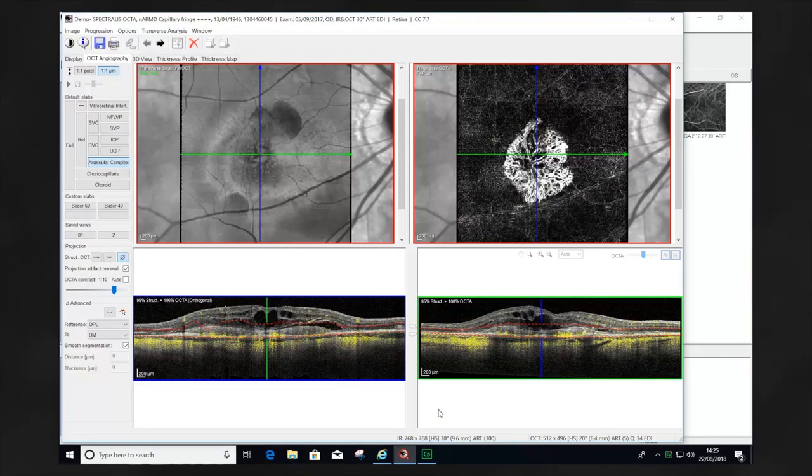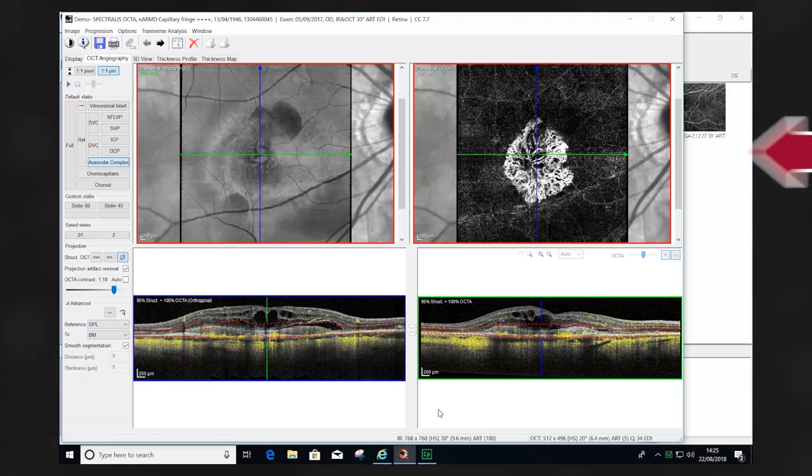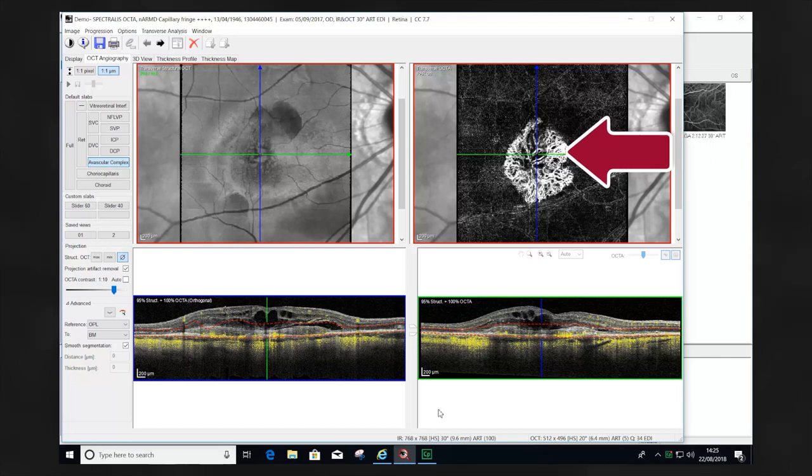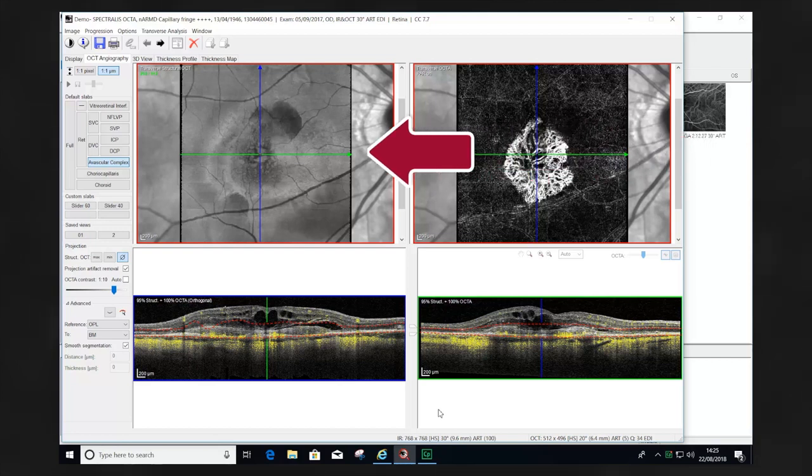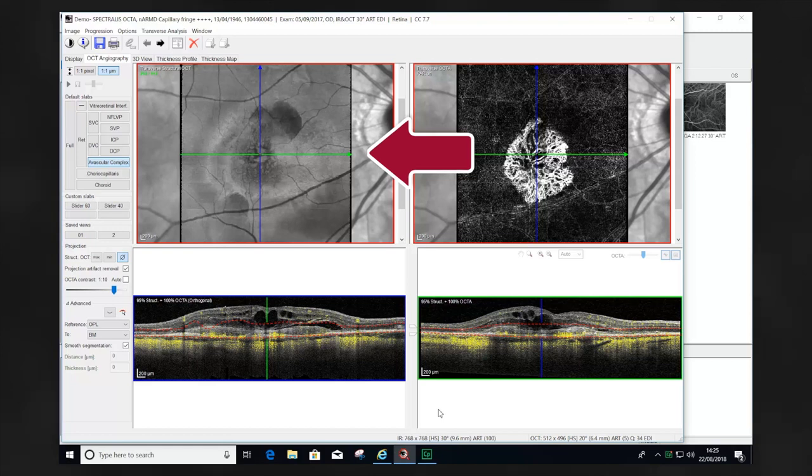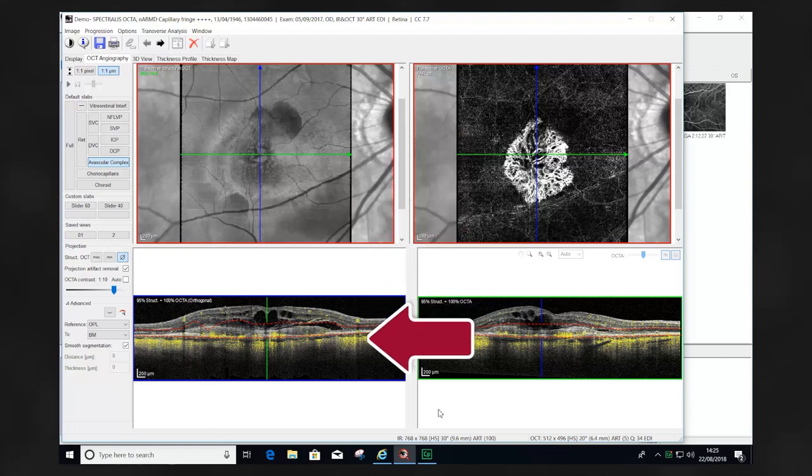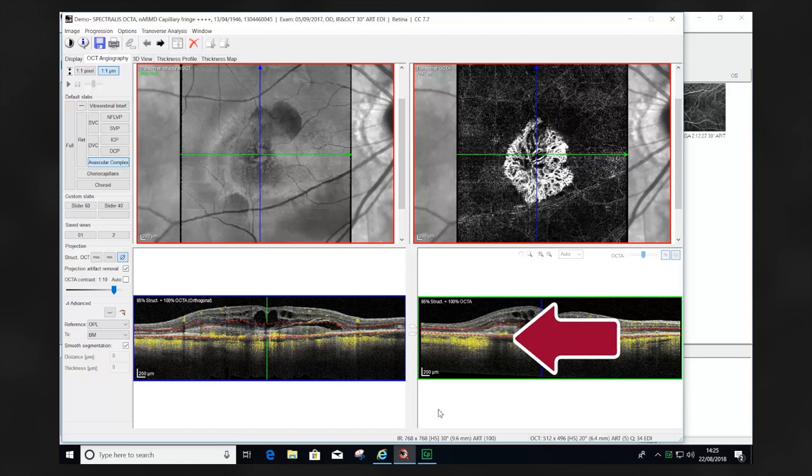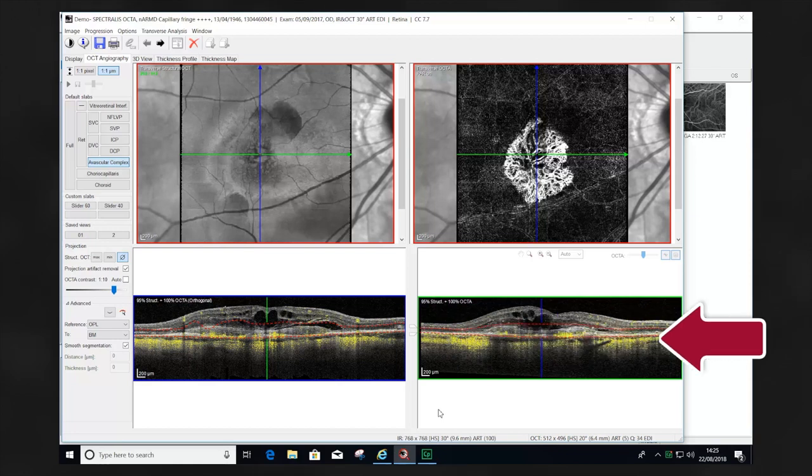The OCT angiography window provides four images: a transverse section OCTA image, a transverse section or enface structural image, an orthogonal or vertically oriented B-scan image, and a structural B-scan or horizontally oriented image.